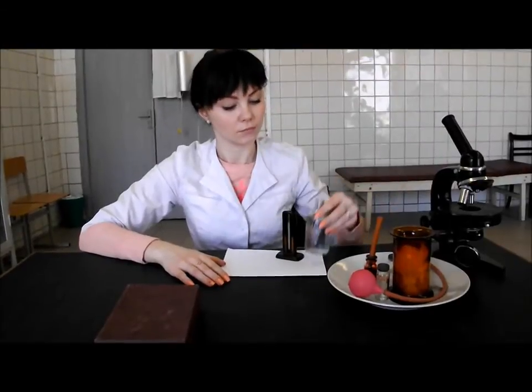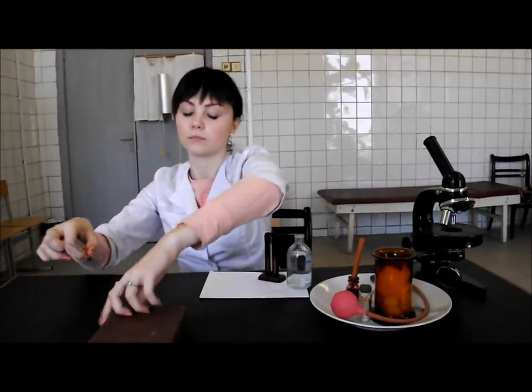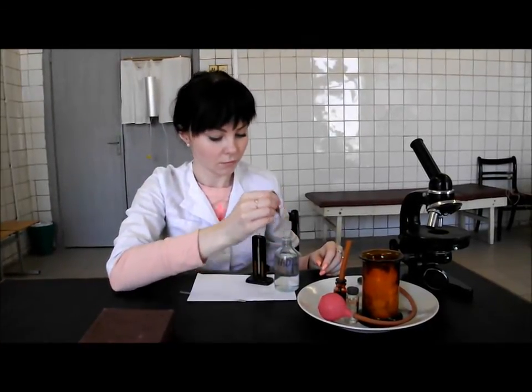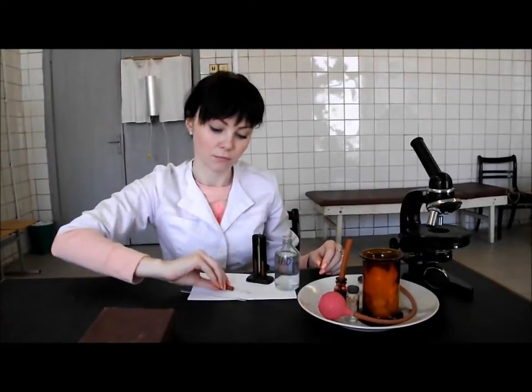Add distilled water drop by drop into the test tube using the specific pipette from the box with the mark 'water', until the color of the solution matches the color of the standards. During adding water, mix the contents with the help of the stirrer from the box.